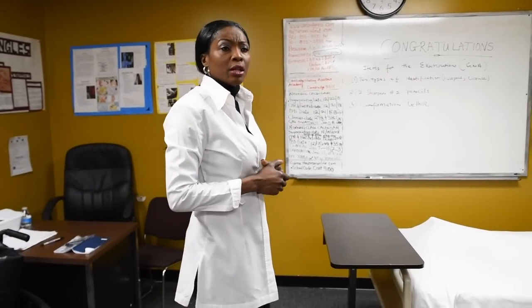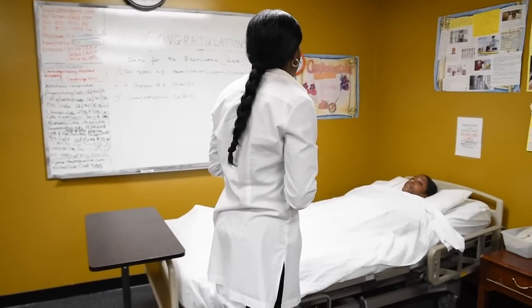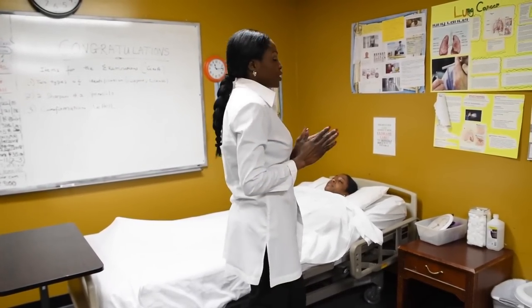I've looked on my scale form. This is what I would do. Okay, I go to my client. Hi, Mr. Fisa. I'm here to weigh you. Is that okay with you? I'll be right back. Let's write this down.